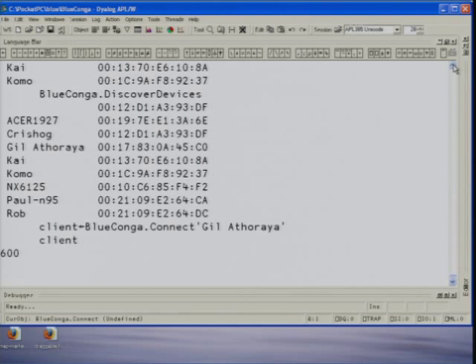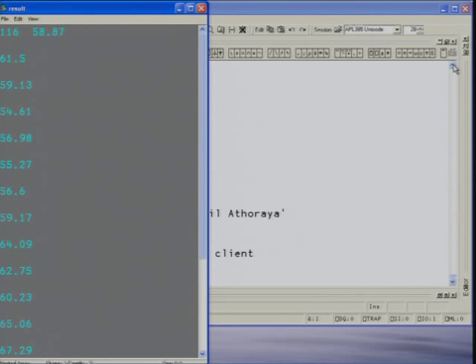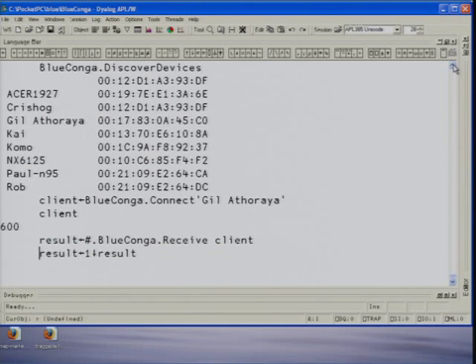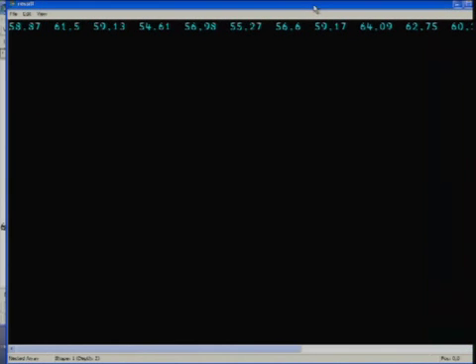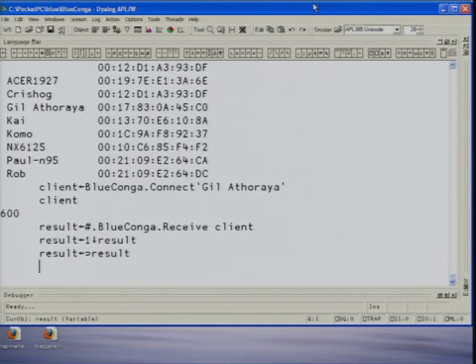The server application on the smartphone is just sending out heart rate figures, randomized heart rate figures, and it's just waiting for a connection. So as soon as I connect it now, it's been sending things to me, so I can look at the result by reading from the socket. And oh, I forgot it returns a return code there, so I'll just drop the first one. Just showing me how much data it's actually downloaded. And a little bit useless at this. Let's see.